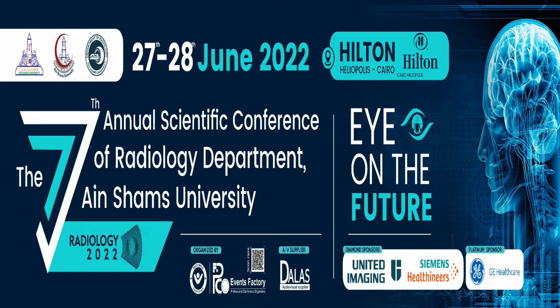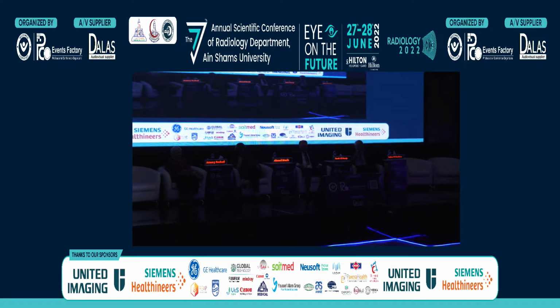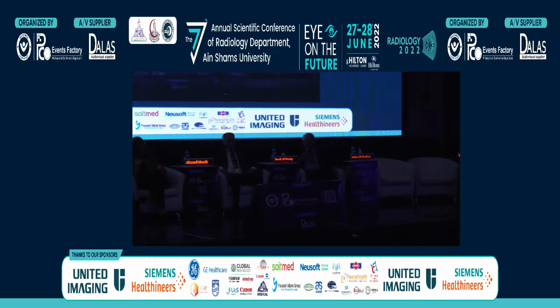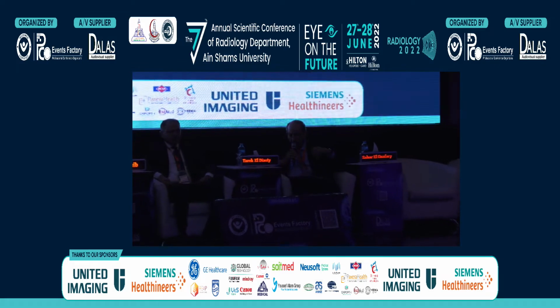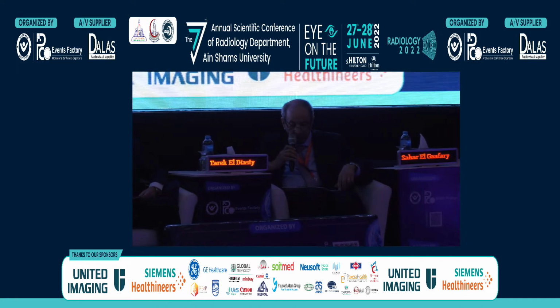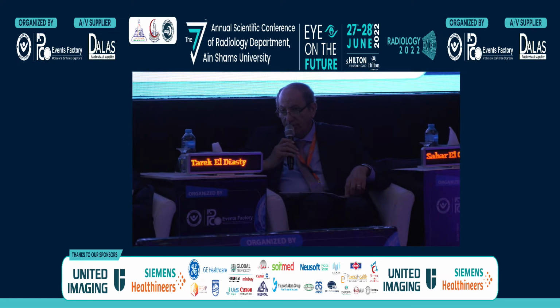Thank you so much. I have a question regarding the dynamic contrast enhanced study. I noticed that in many cases there is only diffusion and T2 weighted image. Do you recommend to reserve the dynamic for indeterminate VIRADS on diffusion and T2, or is it a must to do it for all cases?